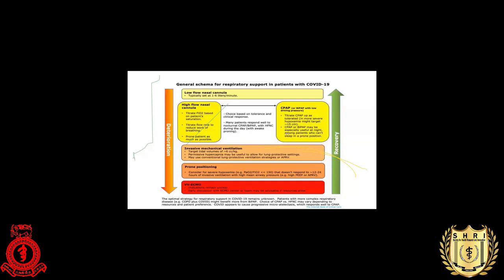The question about the FiO2, Bhaginder, as Chamara said, we have only ResMed 100. If it is 150 or 200, then only we can measure the FiO2. Otherwise, we can have a rough idea about oxygen. Basically, we give about 15 liters of oxygen, and according to the flow we can increase the FiO2, but only a rough idea, not an accurate one. When you have a ResMed 150 or 200, then yes, you can measure FiO2.